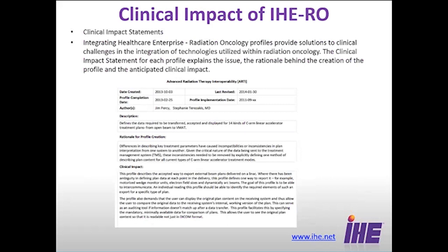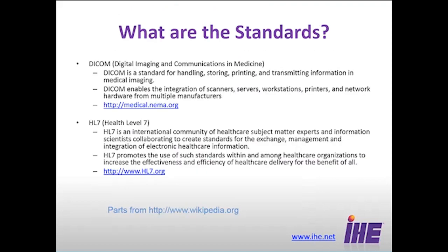This is one for ARTI, Advanced Radiation Therapy Interoperability. We'll talk a little more. I use this example several places. If you take a look, you have two authors on this. One of them is a member of a vendor, and the other one is actually a physician, and we normally try to involve physicians in writing the clinical impacts, physicians or real clinical physicists, to make sure that we have things right. And these are posted for people to read and discuss with us and help us refine things as needed.